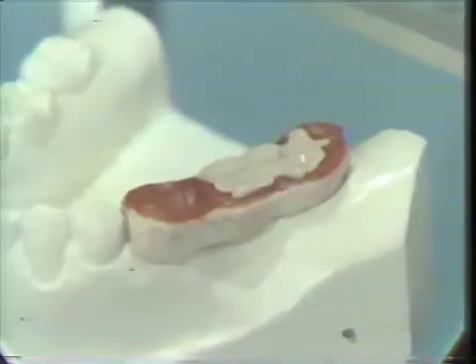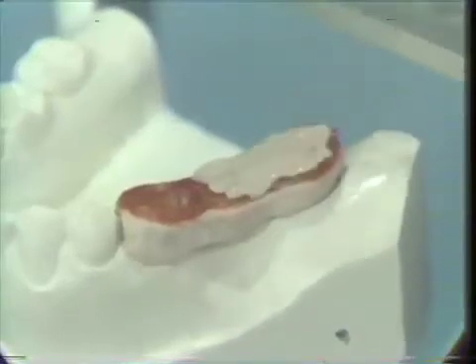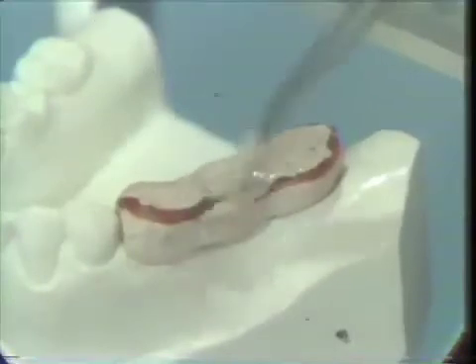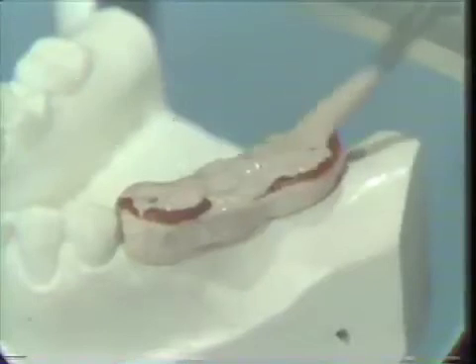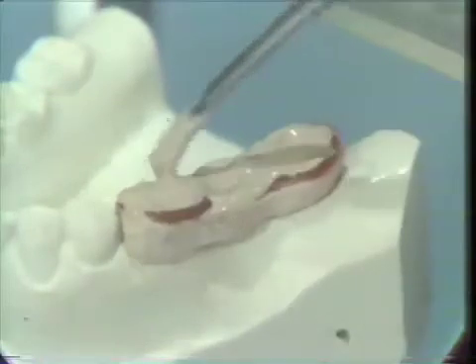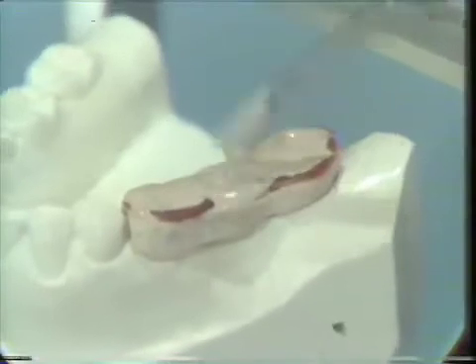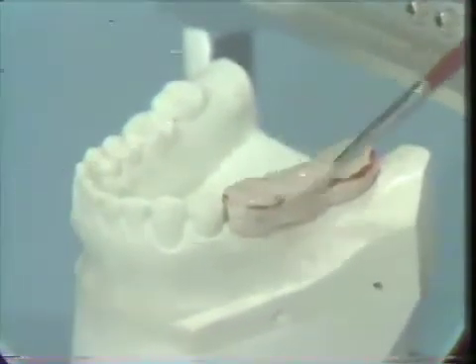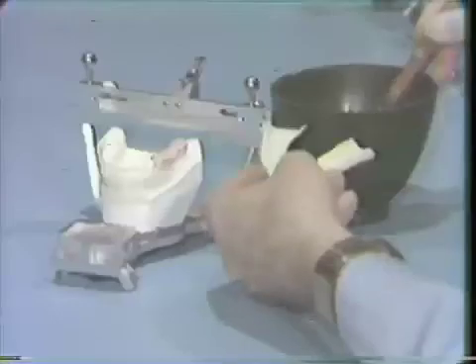Normally this stone will set up in approximately 2 minutes in the mouth under normal conditions, and paint all of the areas, being sure that we work it in so that we get good detail with an absence of any bubbles or voids, because this will be what we will subsequently be using to generate our occlusion in this area. And the more crisp registration we have, the better the final registration.